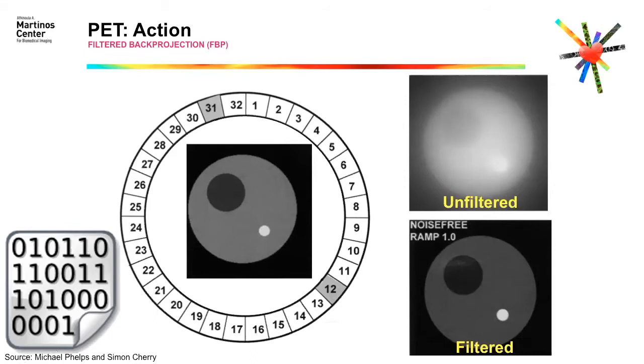This is the gold standard, by the way, of image reconstruction in positron emission tomography. But this is the old way to do it, even though it's the gold standard, and it's the only version that is still unbiased in terms of PET quantification. Nowadays, we are doing iterative methods, which are much faster and less noisy. And the bias is nowadays very little compared to FBP. So we are accepting these iterative methods, which give us better solutions to the image, so we can obtain images that are qualitatively and quantitatively pretty good.